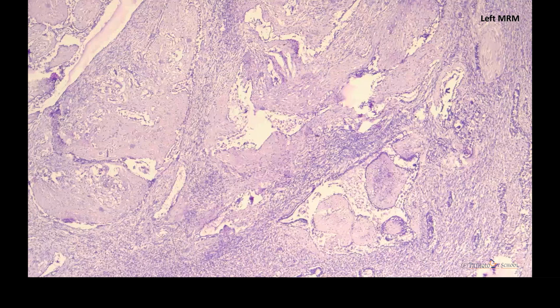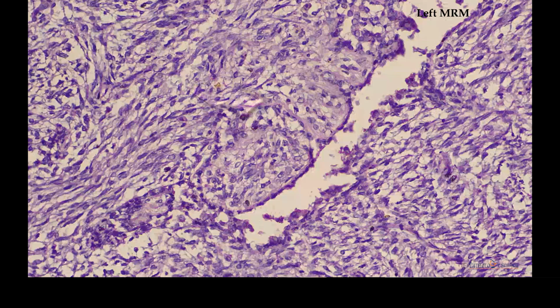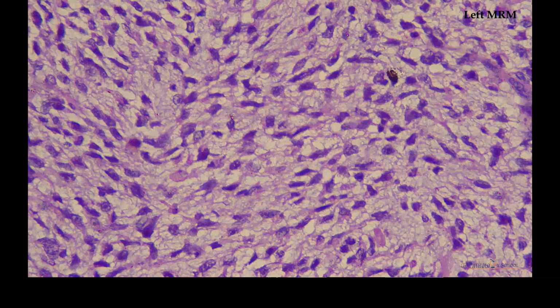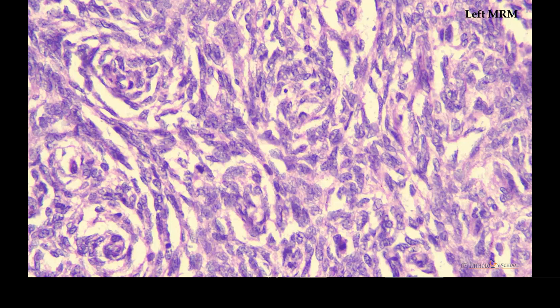And these are the benign epithelial components. Some of them showed leaf-like architecture, with both ductal epithelial as well as myoepithelial cells at the periphery of the epithelial component. And this is the high power view of the benign ductular component with surrounding increased stroma. Increased mitotic activity was seen. Again, moderate pleomorphism, increased mitotic activity, and hypercellular areas.